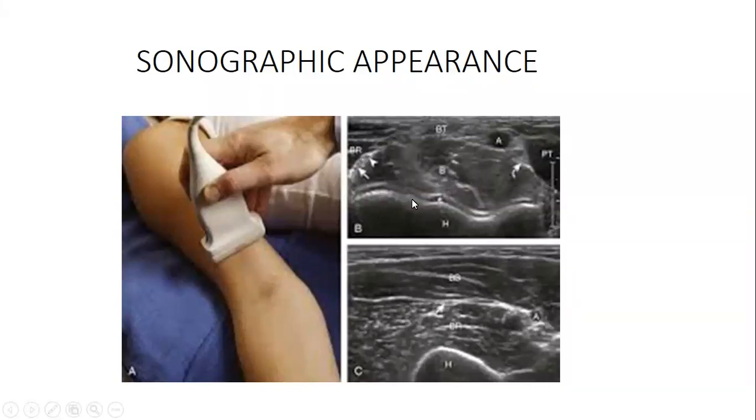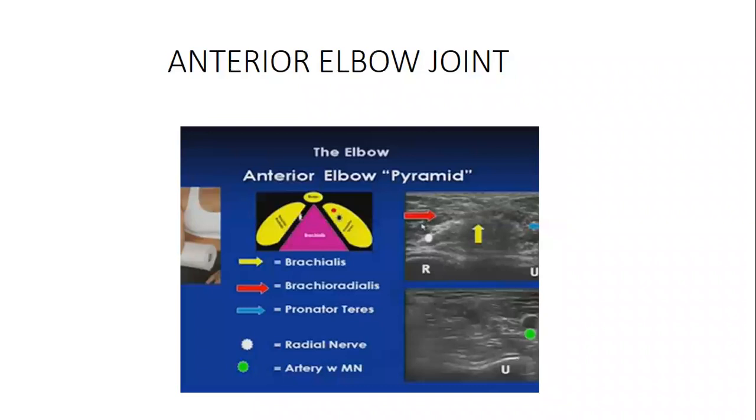And you must also understand the appearance of the joint, the hyaline cartilage, this echogenic line. It must be smooth. The contour must be very smooth. You may be dealing with pathological conditions, things like osteoarthritis. You can be dealing with other irritative pathologies. This joint may also be increased on ultrasound. You may also see it. And once you understand specific anatomical structures, it's going to help you. I think I've got nice images, so I'll still show you.